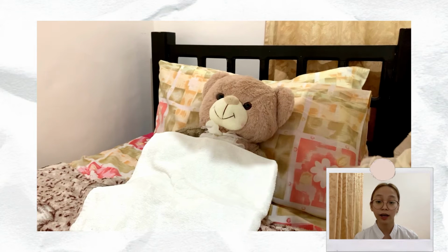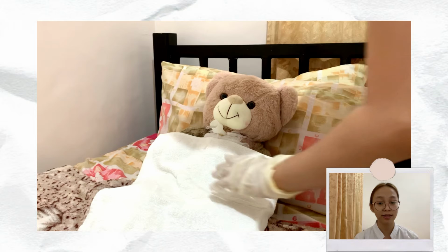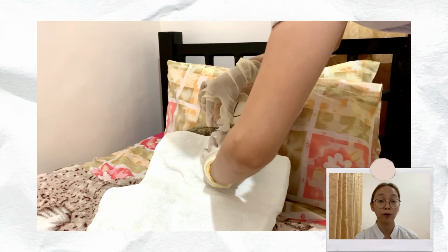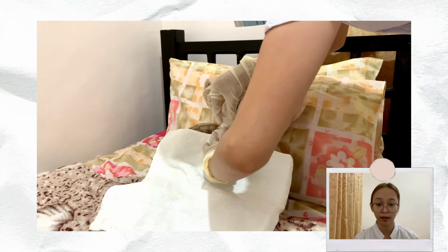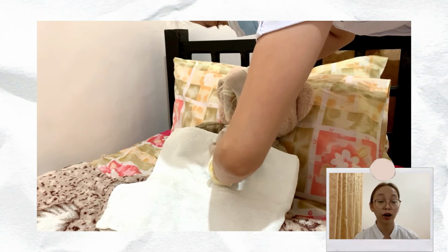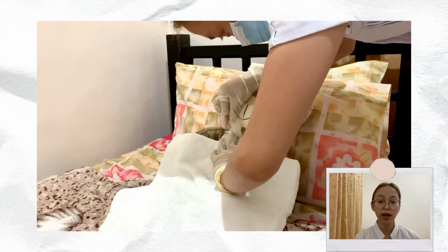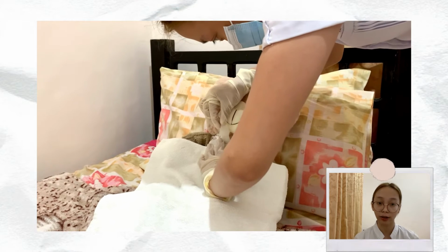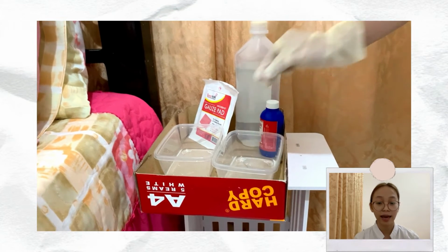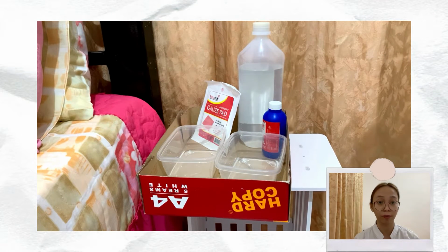Number 13, remove the oxygen source if one is present. Stabilize the outer cannula and face plate of the tracheostomy with your non-dominant hand. Grasp the locking mechanism of the inner cannula with your dominant hand. Press the tabs and release lock. Gently remove inner cannula and place in first basin with plain NSS and H2O2. Let it submerge there for a few minutes.